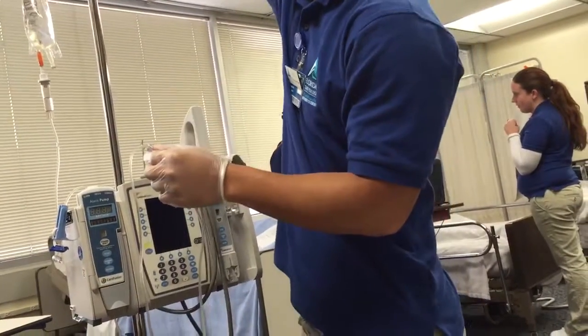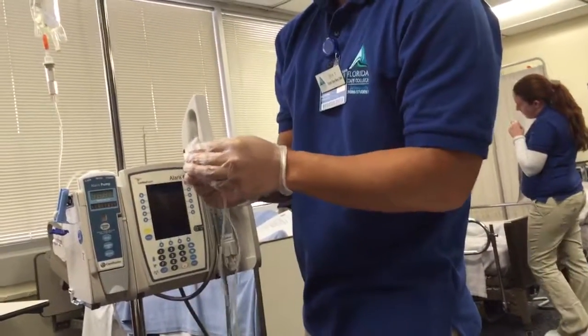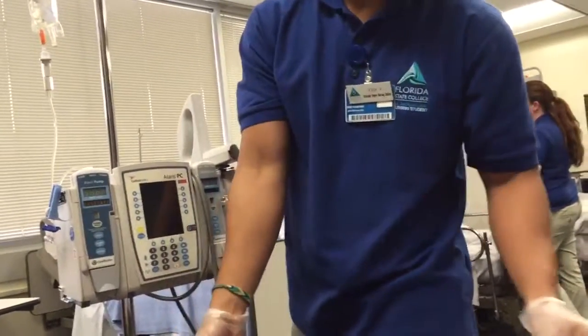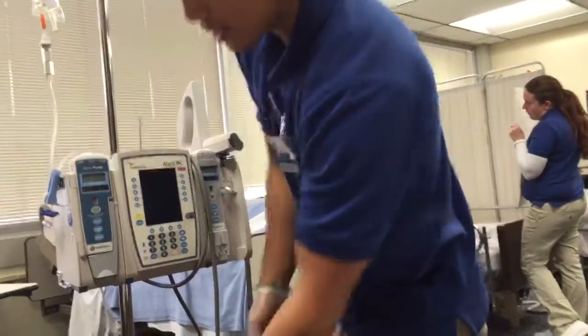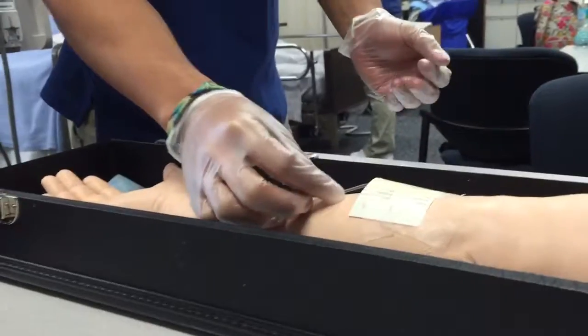So the piggyback is done running. Then I'm going to go ahead and clean the port again. And then after that, I'm going to go ahead and just make sure that the site is still good and still patent. There's no signs of edema around there, no pain or redness.